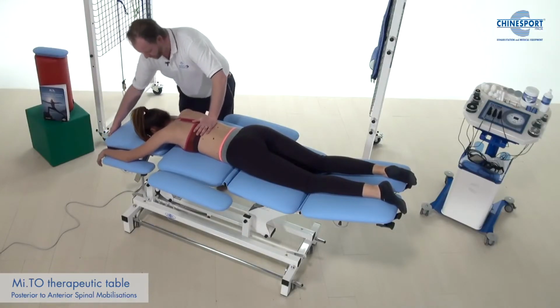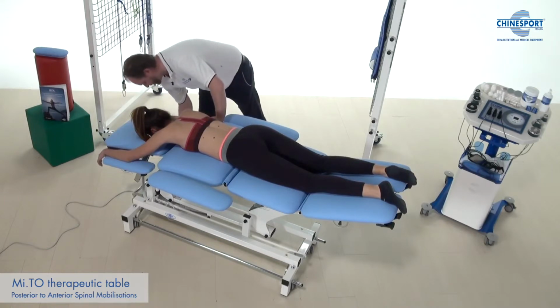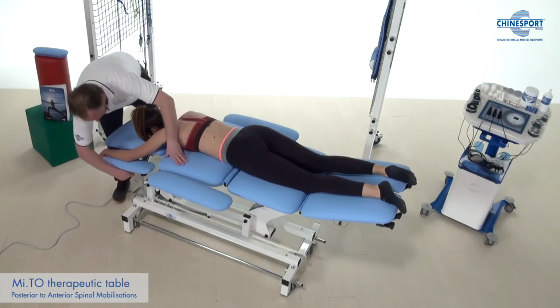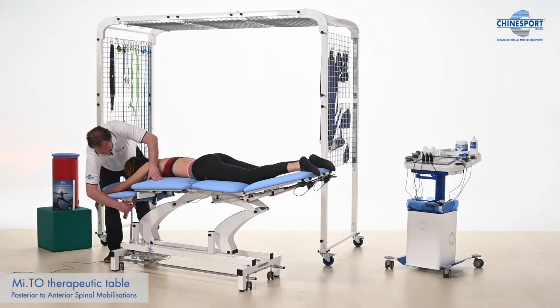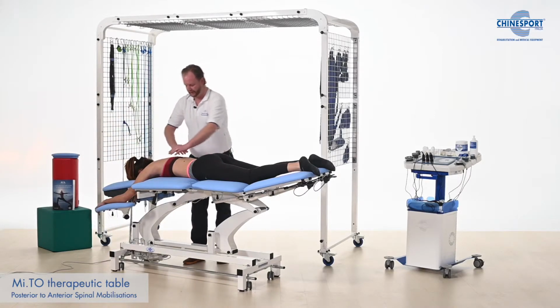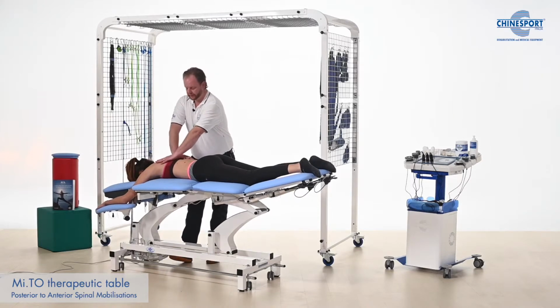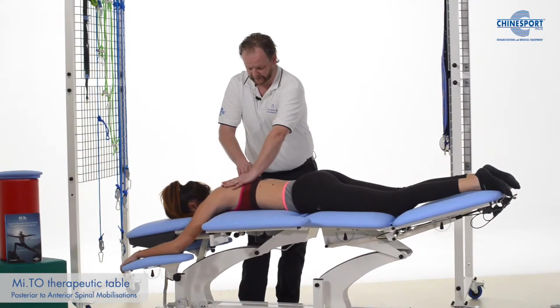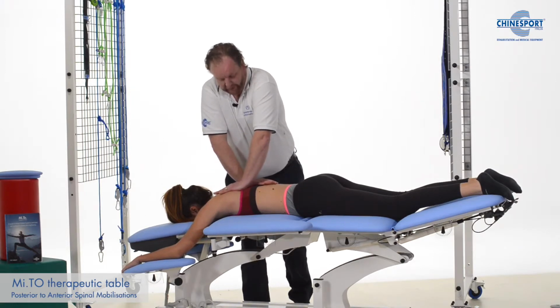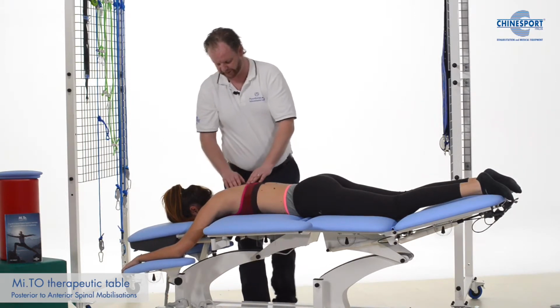And if I want to do some mobilizations of the thorax, I want to relax the shoulders a little bit more, not have them so far up. So we can move these segments down. She can relax more, open up more, the scapula fall into abduction, and we can go down. And we can make our mobilizations. Breathe in, breathe out. And we can provide an impulse if we want.